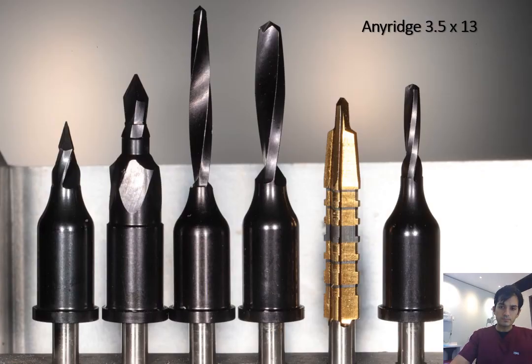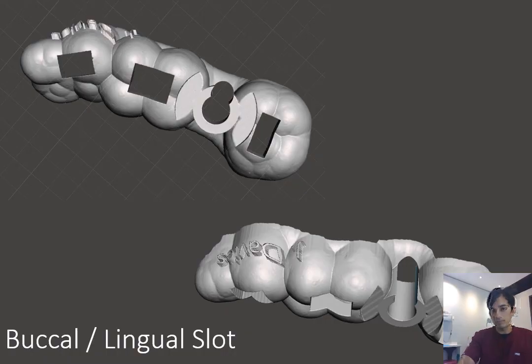Moving on, to place this implant, the 13mm long AnyRidge, you can see the regular gold twist drill, where the 13mm mark is the line coronal, or in this case below the thick black band. And the length of the 13mm drill is roughly the same length as your guided stopper drill of 7mm, as you see on the right. Now, you could always use a 7mm drill if space is limited, which is the same length as your regular drill. Create that initial osteotomy and then switch to the longer drill, and it's easier to insert it.